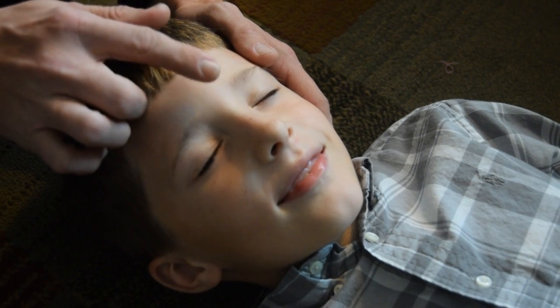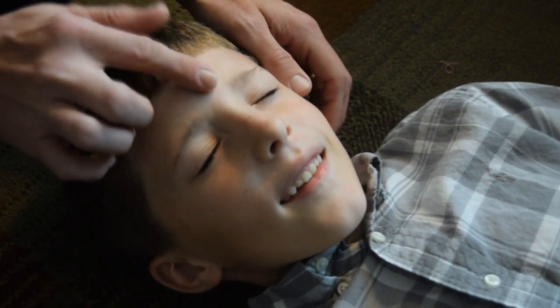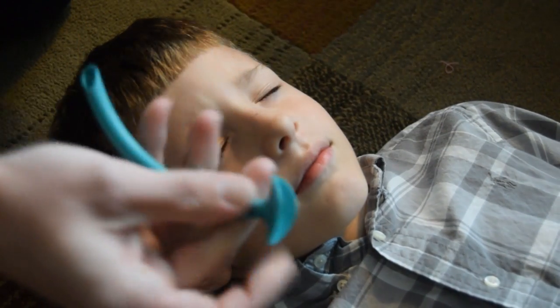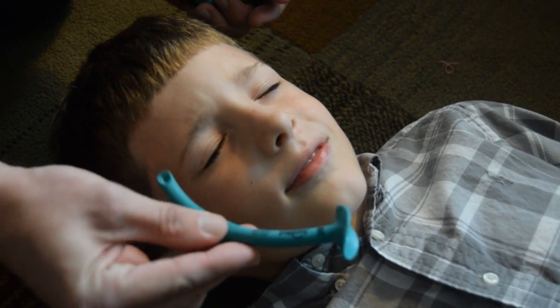The other way is the tap on the forehead — just a simple tap like that. And you see how his eyes are flickering and moving? He still has an intact gag reflex, meaning that if I inserted this OPA into his mouth, he's going to vomit. So I could go with a smaller NPA and insert an NPA into his airway instead.